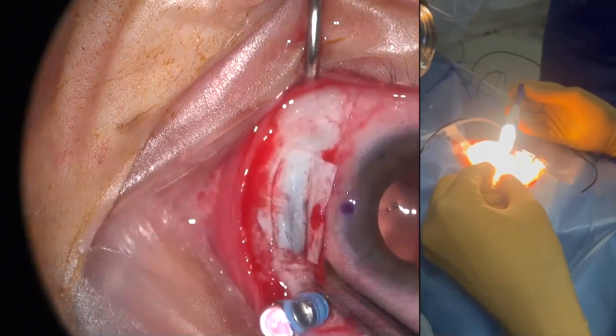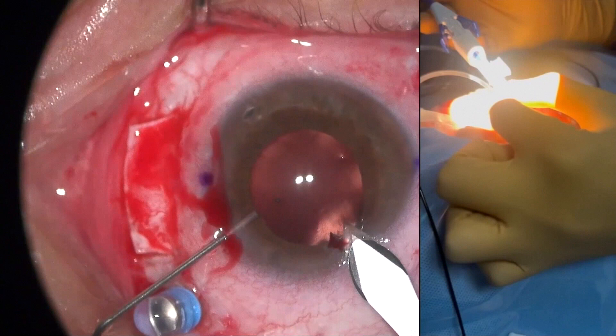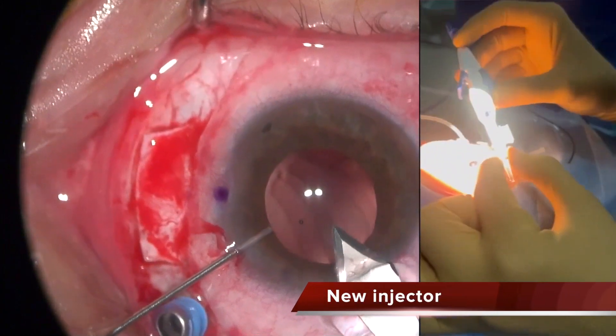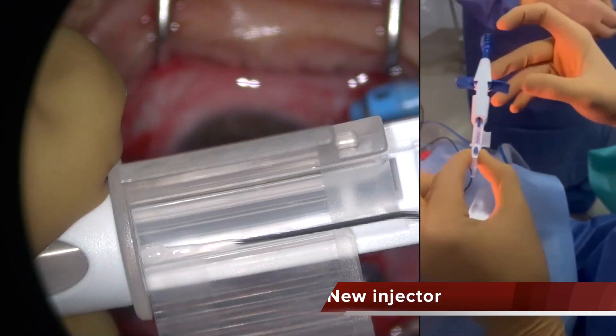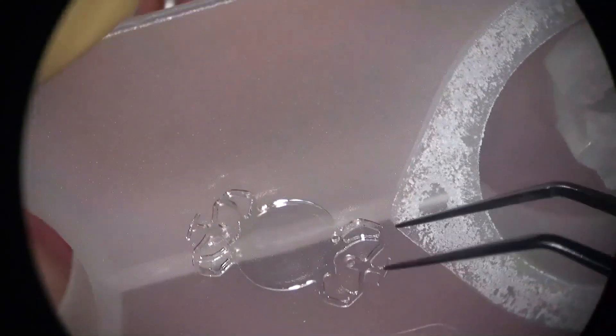And now you are going to see the new injector, which is a superb injector. This lens is a little bit more rigid than the hydrophilic one and needs to be injected through a three millimeter incision.